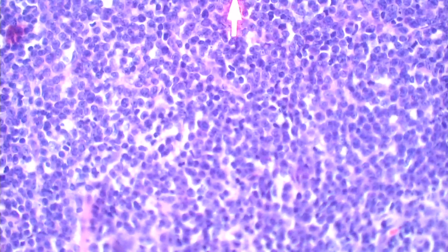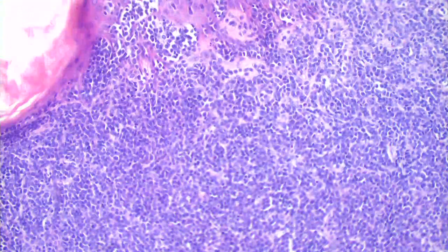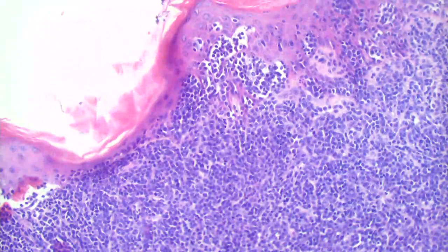There are mitotic figures all over the place. Very atypical lymphoid cells. Lots of open chromatin. I have a kidney bean shape there. Convoluted cell up here. Okay, so is this more likely to be a T or B cell lymphoma? I think a T cell. T, good. Why?